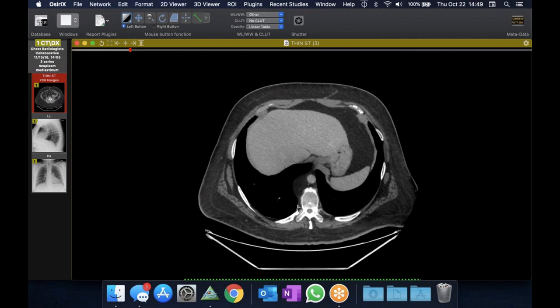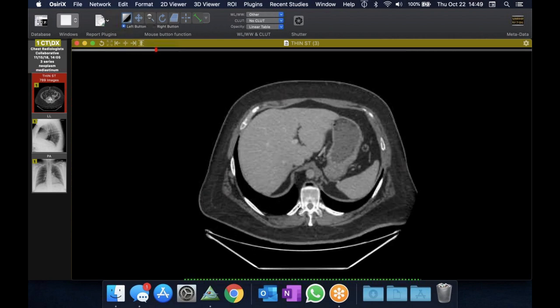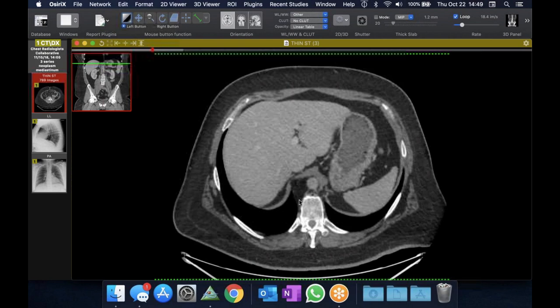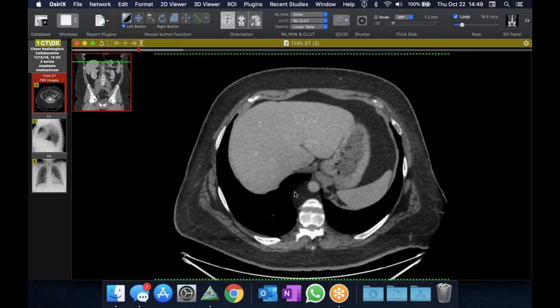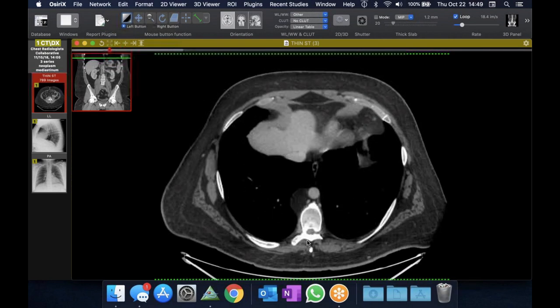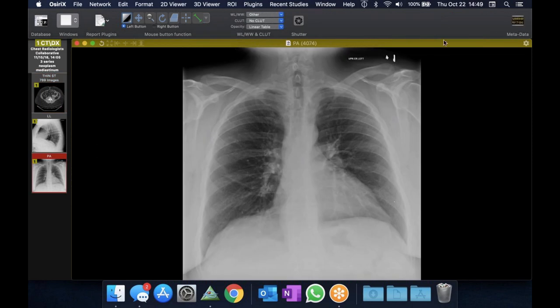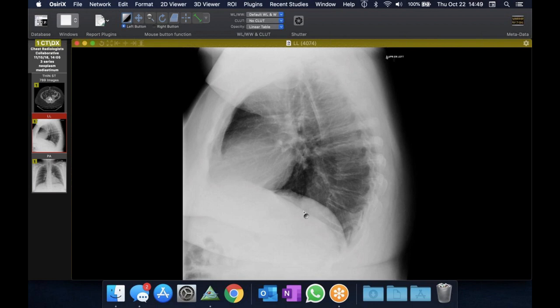And you're more likely to see a hernia containing fat from the abdomen coming up there, but this is just a true lipoma. It looks to be like a little capsule around it maybe, but I thought it had a really nice radiographic interface. Not too hard if you look at these a lot, but remember to look down here as well. Always look down on the paraspinal lines because sometimes that's where stuff likes to hide. The lateral is going to be a bit more challenging.